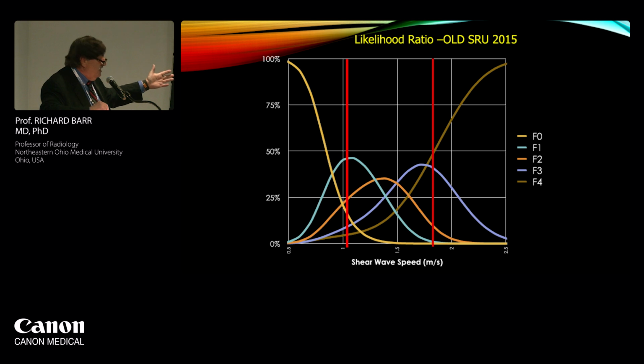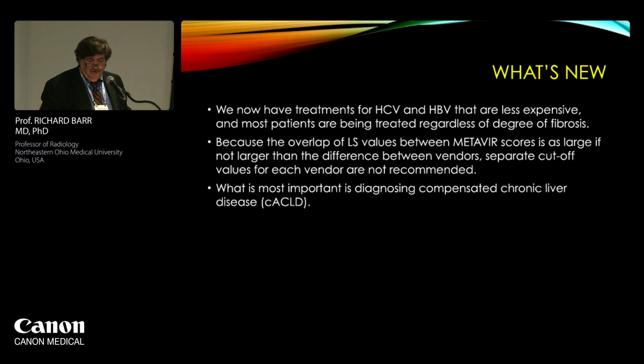So we gave cutoff values, and at that time they were vendor specific, as to a low value below which you had no or mild fibrosis, and a high cutoff value above which you had a very high probability of compensated advanced chronic liver disease. And between those, you had some fibrosis, and you needed to be followed. Now, this data is true for transient elastography, and it's also true for MRE. So all these things that I'm telling you, almost all of them affect both transient elastography and MRE, although they tend to not tell you that.